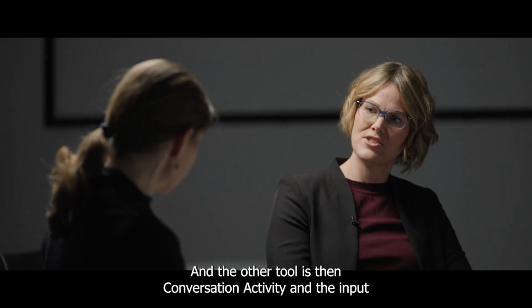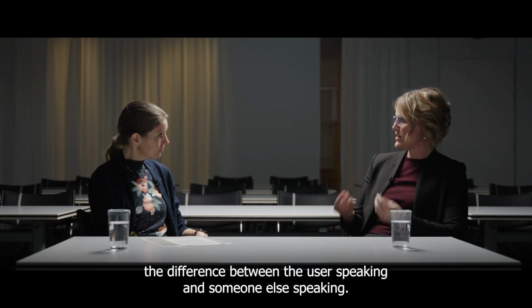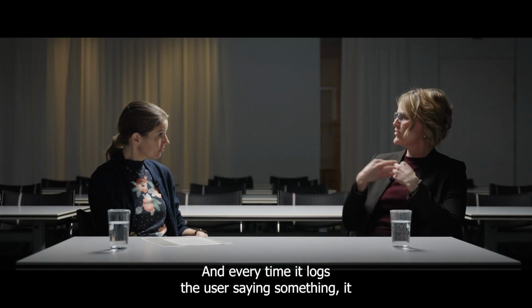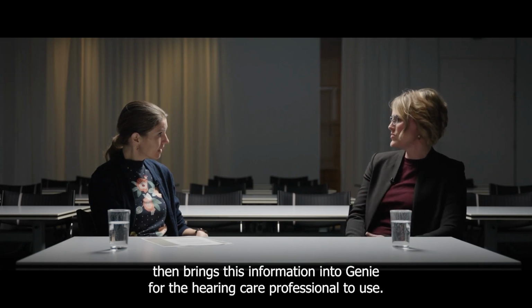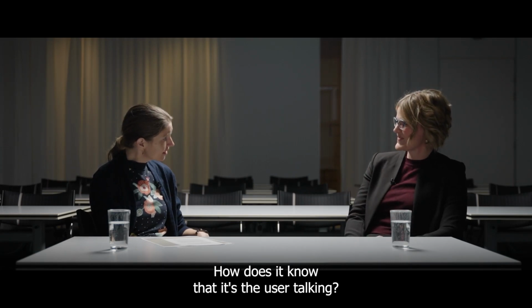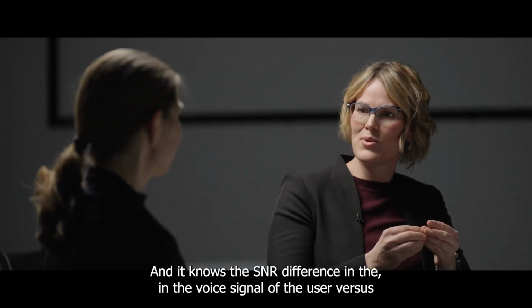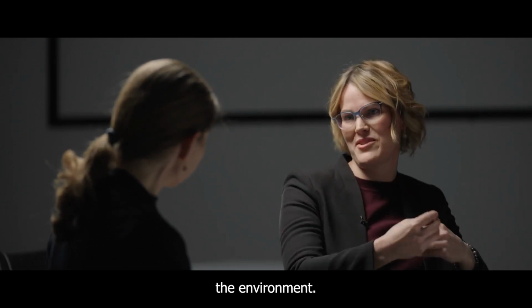And the other tool is then conversation activity. And the input here is a modulation detector. And the hearing aid will know the difference between the user speaking and someone else speaking. And every time it logs the user saying something, it then brings this information into Genie for the hearing care professional to use. How does it know that it's the user talking? It's about the modulation and I think the loudness of it, and it knows the SNR difference in the voice signal of the user versus the environment.